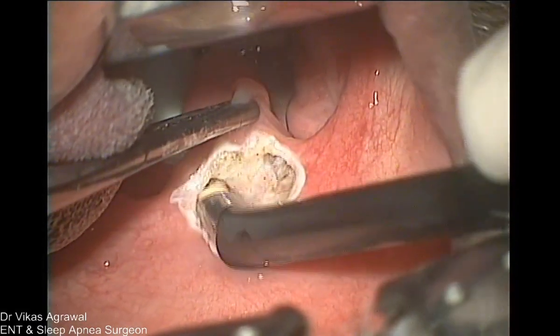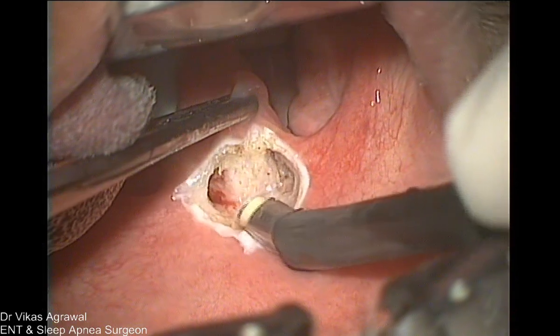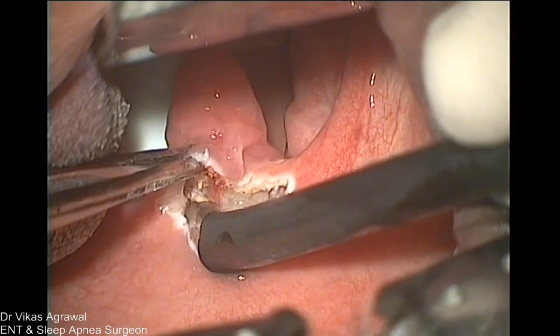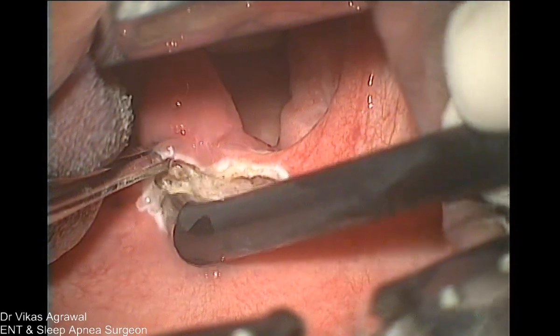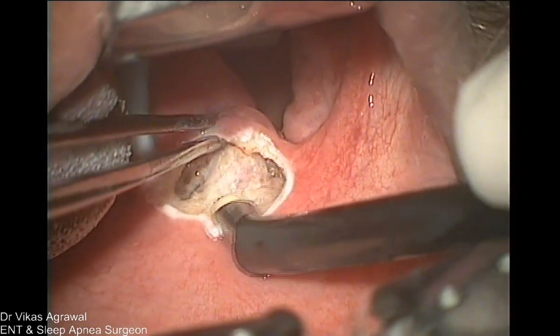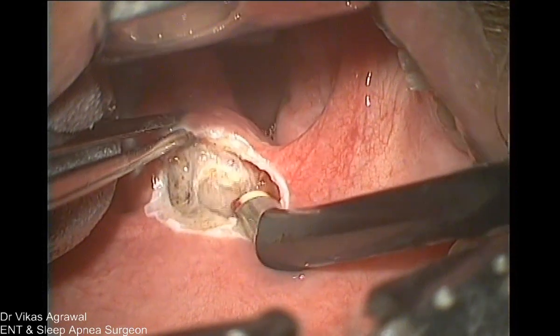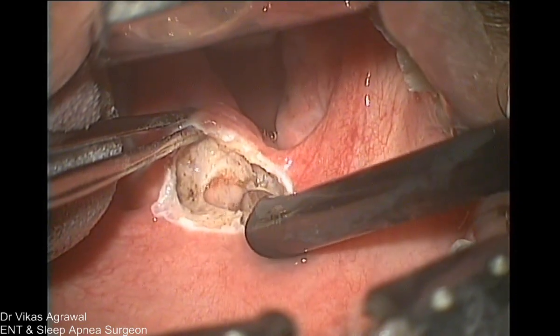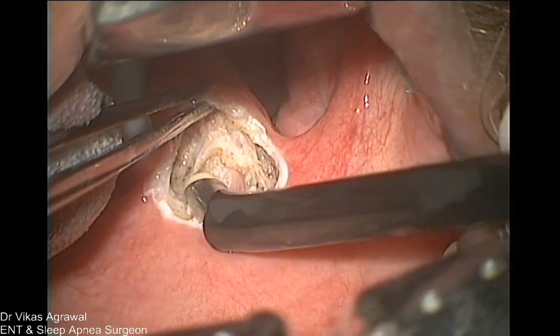Now see, there is some vessel here, superior pole, which you have to see and coagulate. This is the superior pole vessel. Now this is the musculus uvuli. Can you see this? Now see, a big vessel here. Yeah, seen very well. So Dr. Nilesh is here.